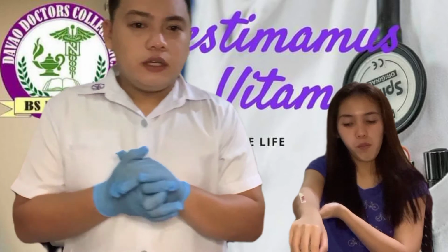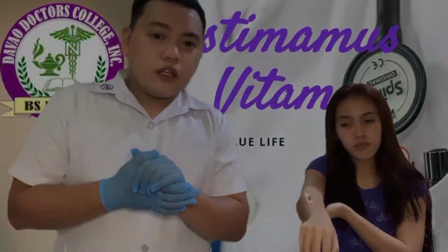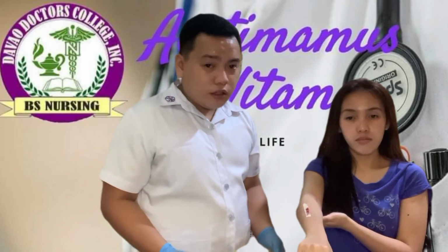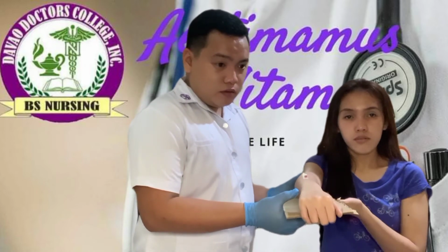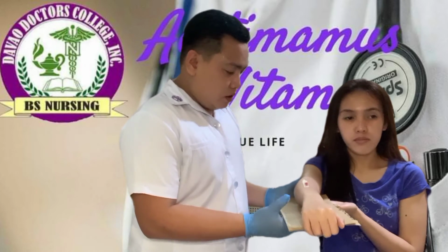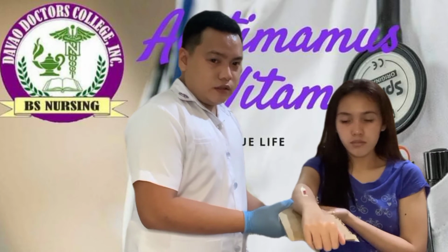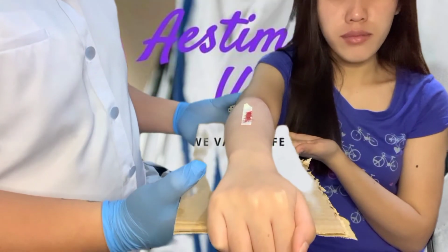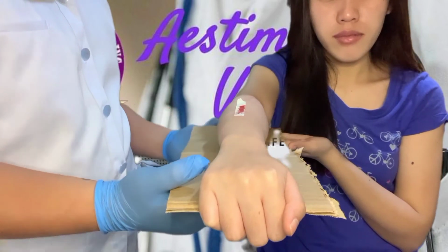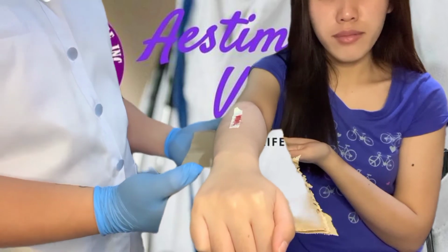So I'll be getting now a rigid board to apply to the patient's broken arm. I'll be applying the rigid board to the patient's broken arm. And ma'am, can you ask the patient to support the rigid board. The rigid board is applied under the patient's injured arm.